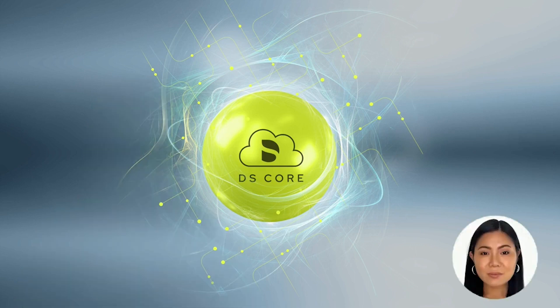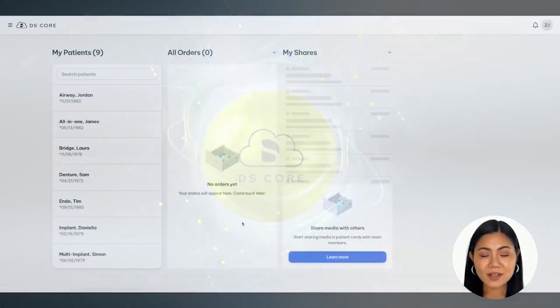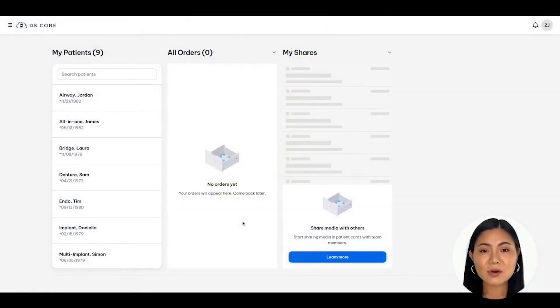First things first, if you are not logged into your DS Core account, go to dscore.com and sign in with your email address and password.